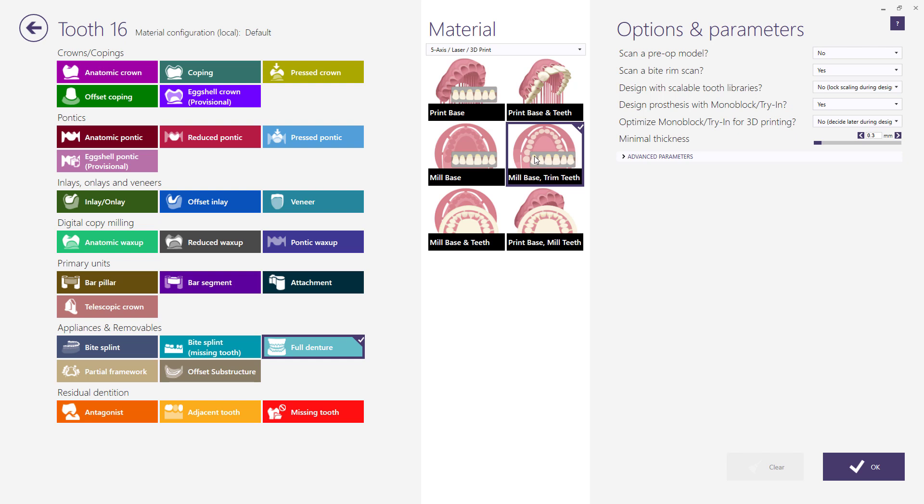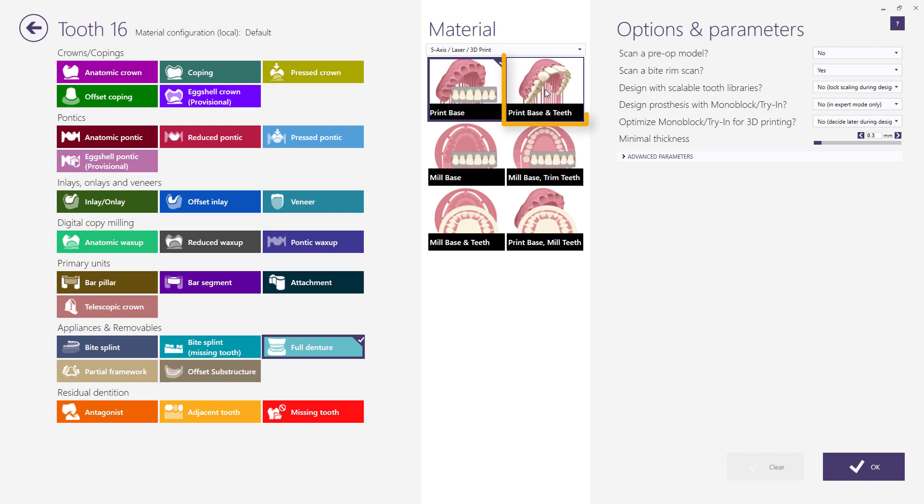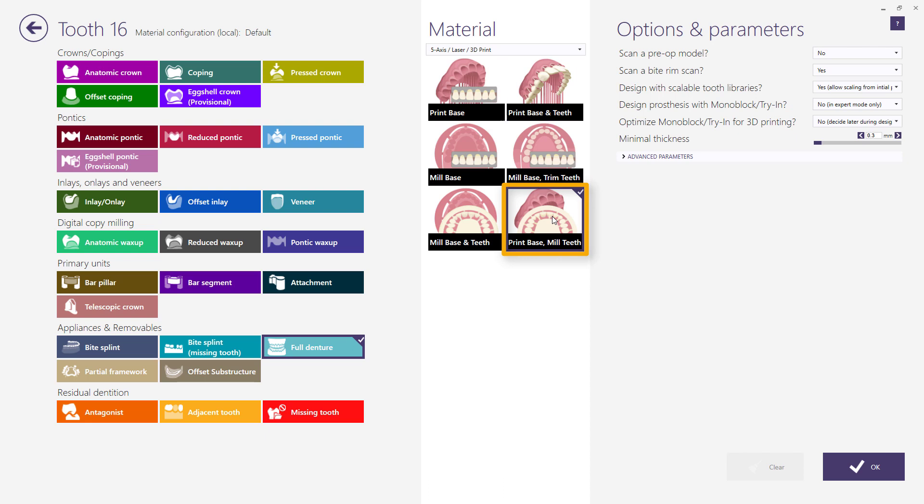For printing technology, you can choose print base if you only want to print the base and use denture stock teeth. Print base and teeth if both the base and the teeth will be printed. And print base mill teeth when you print the base but mill the teeth.